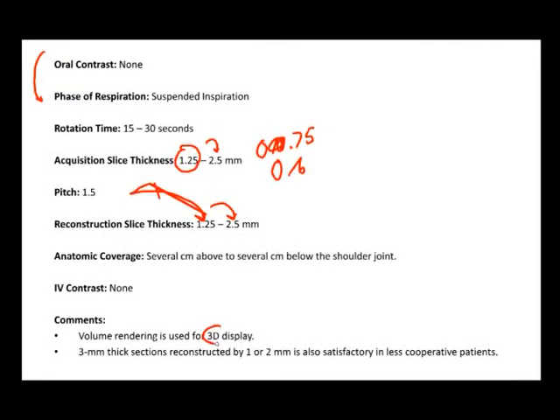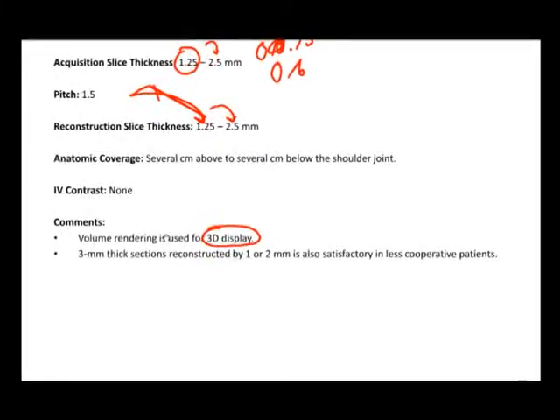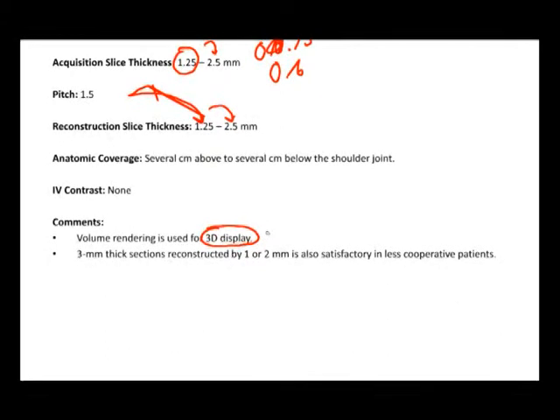Volume rendering is going to be very useful. We all know volume rendering is a 3D display. One thing that I would like to caution you on, though, is that if you utilize it and you remove too much of the bone, many times you can degrade the image quality that you have. And one thing that I've really noticed about volume rendering, although it may not be like this on all scanners, is that if you don't have great bone density, volume rendering tends to look pretty sloppy, simply because you burn through. There's not enough data for these points.